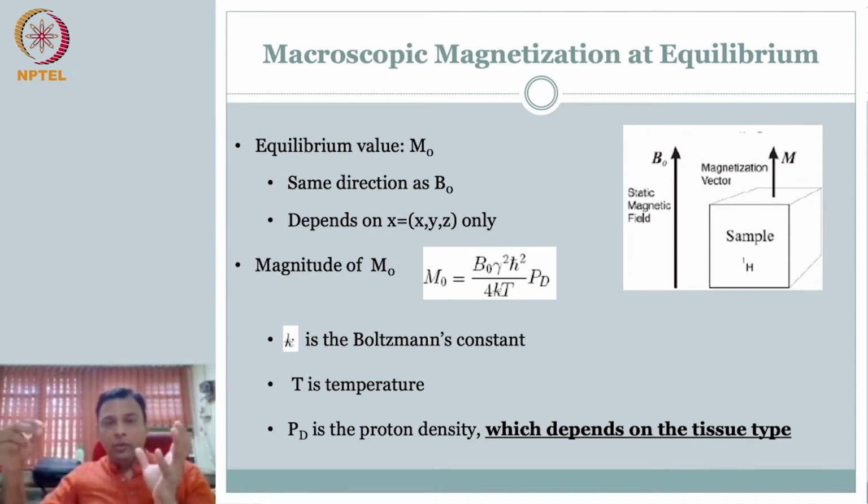How do we record and what is the signal? We already spoke initially, right? We have to record this magnetization. If you have a magnetic vector that is looping, then I can actually get a current, put a coil, get a current that will be proportional to this. So we'll get to the details, but essentially this is the signal origin that we are talking about.